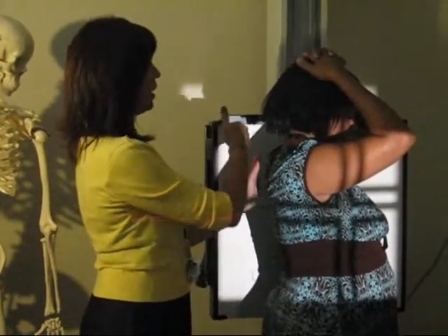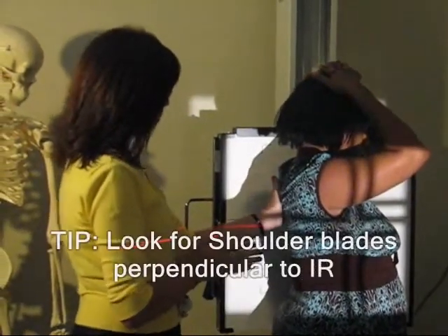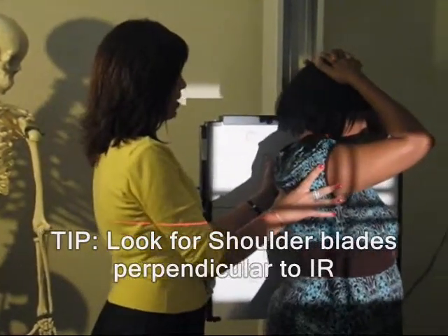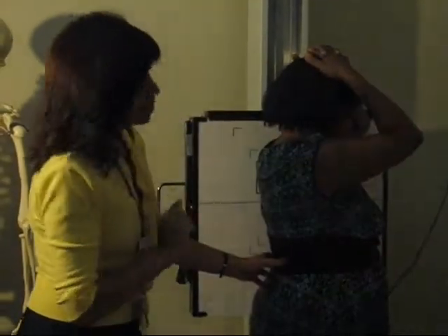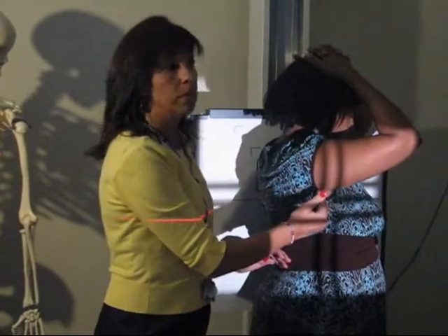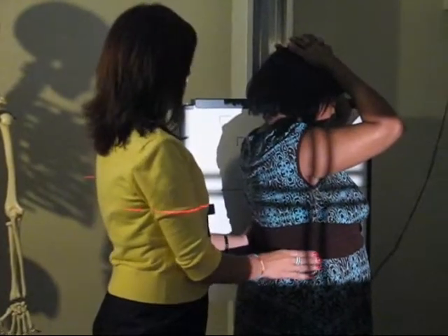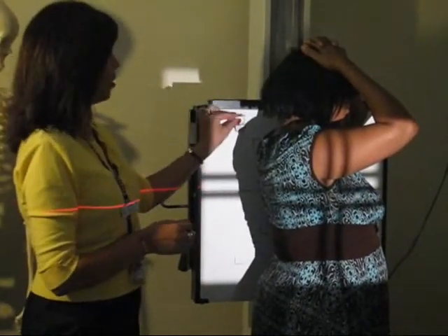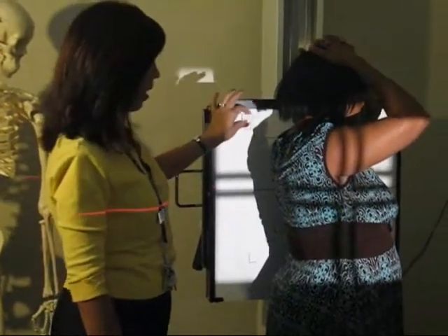You want to make sure that the patient is perpendicular to the IR. It helps if you put your hand perpendicular to the IR and make sure that her shoulder blades are perpendicular also, okay? You want the central ray to come right underneath her axilla and right down the middle of her body, okay? You would have put your left marker where it does not interfere with the body part that you're trying to x-ray. Okay?